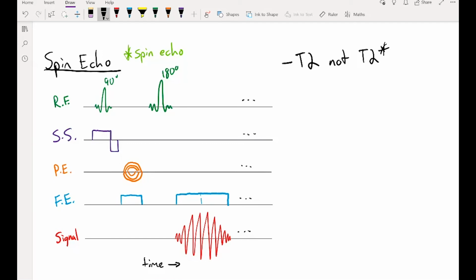So our spin echo, our 180-degree pulse, actually just causes all of those imperfections in our scanner to balance themselves out by accounting for differences in precession frequency that are driven by things like imperfect gradients. Now, another benefit of spin echo is that we can use the exact same gradient. You see how this frequency encoding gradient, let's highlight it in orange, that's introducing dephasing is positive. And so is our frequency encoding gradient that we apply during readout.